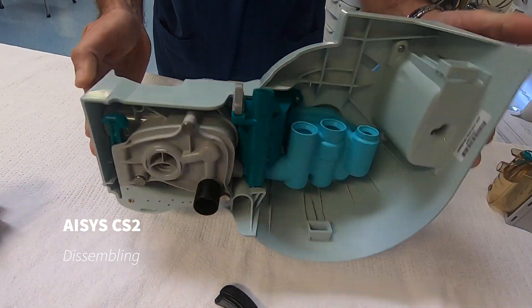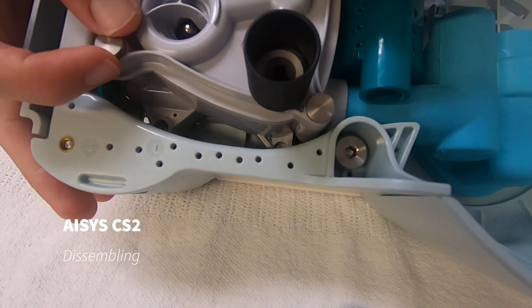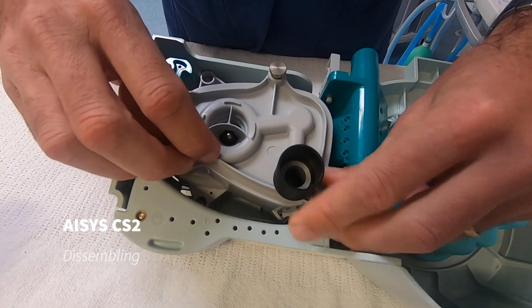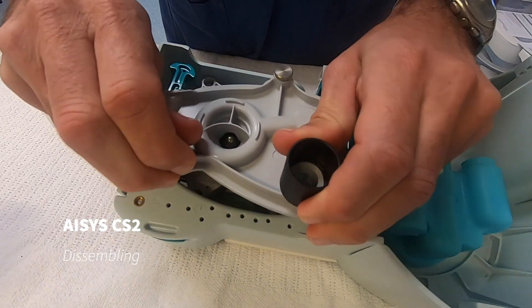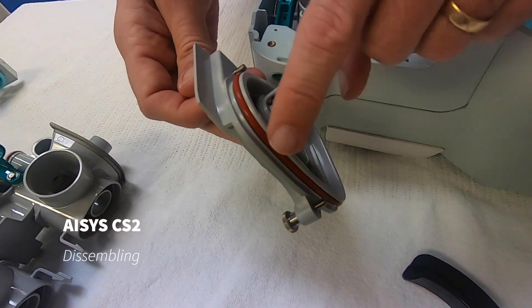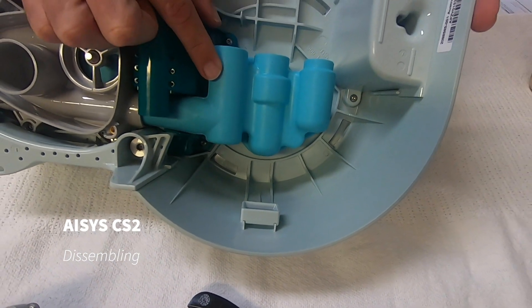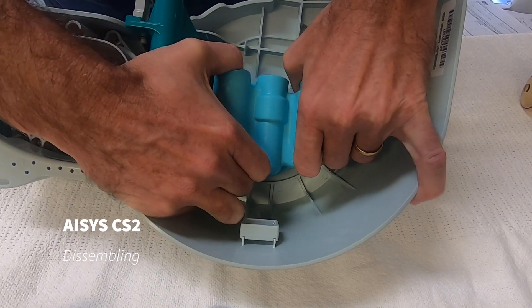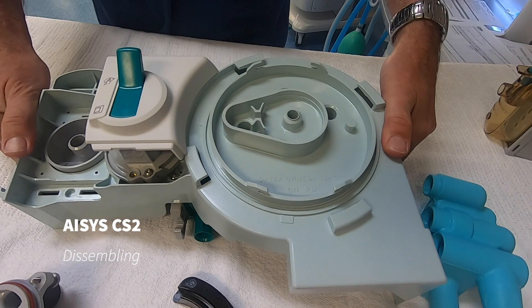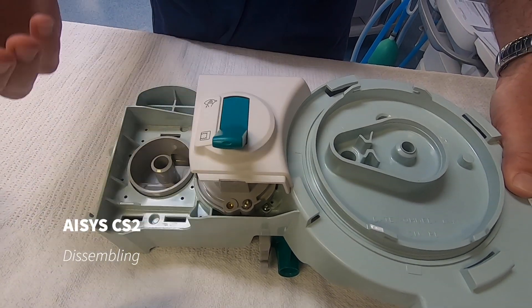Now we can flip this over. There are three thumb screws here that are loosened before this assembly can come off. At this stage — or at any stage — there's never a need to remove any o-rings, as that will just damage them and cause further leaks. The last piece is to remove this manifold by lifting it up and out. Before it's sent to CSB for cleaning, this must be in the vent position so it opens up some lumens inside, allowing water and detergent to get in and clean it.